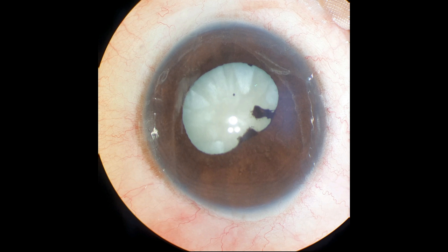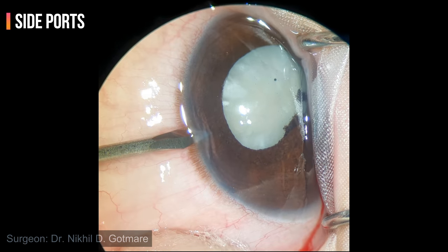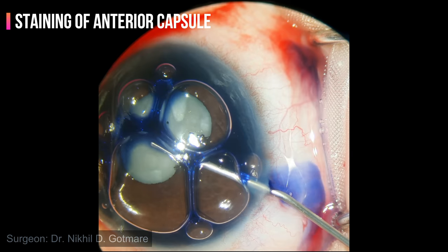Let's look at the steps of surgery. This is the maximum pharmacological dilatation that could be achieved, which is around 4 mm. Side ports are created. The visible portion of the anterior capsule is stained with trypan blue dye under an air bubble.